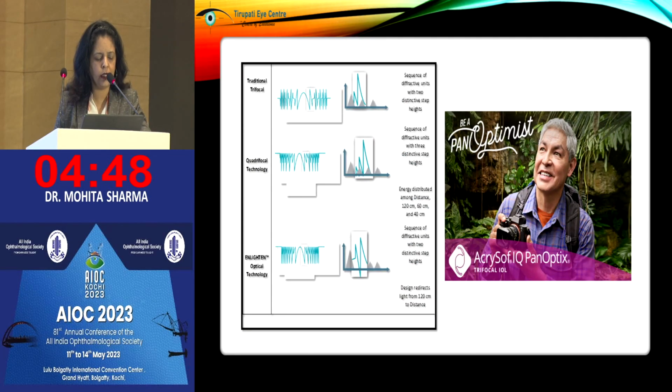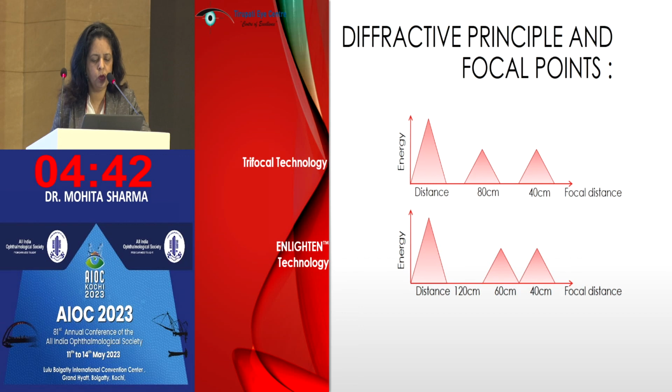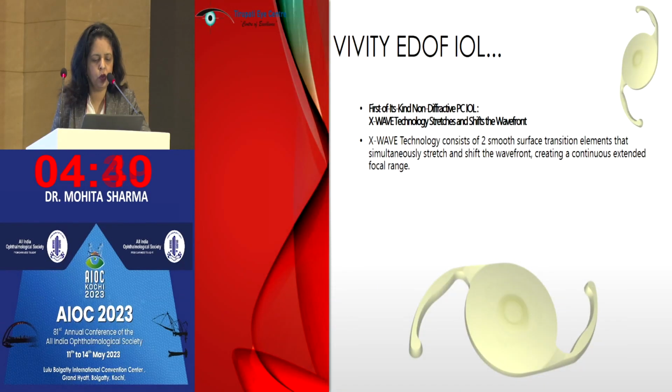This is called Enlighten optical technology. Talking a little about Vivity, because the principle is a little different from all other EDOFs. As again Dr. Dishita said, all these have proprietary technologies, based on acrylic designs, and there are rings which are proprietary designs of companies.